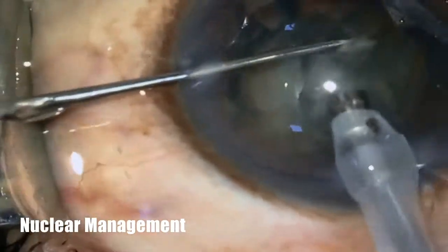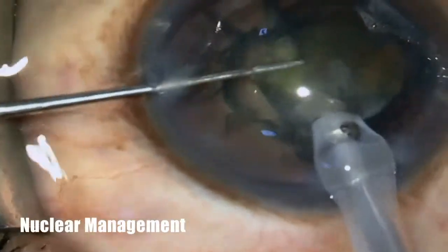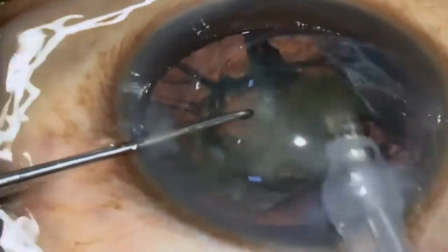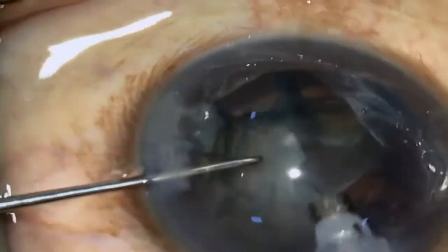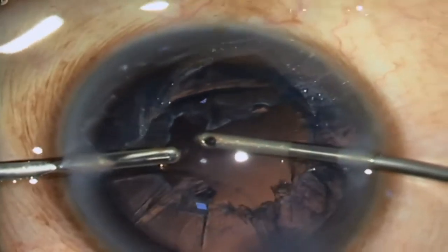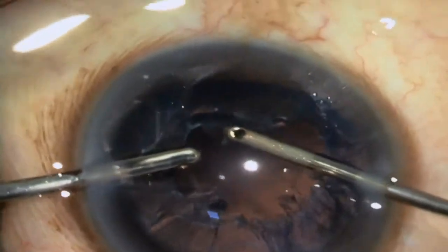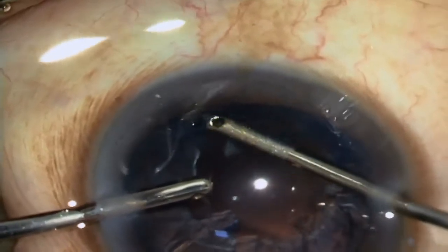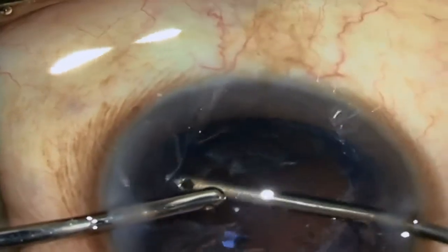The nucleus was divided into fragments and they were emulsified. For irrigation and aspiration, the chopper was removed first and replaced by the irrigation probe, then the phaco probe was removed. Through the side port, the aspiration port was introduced and then I/A was carried out.